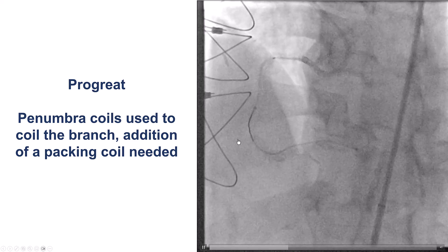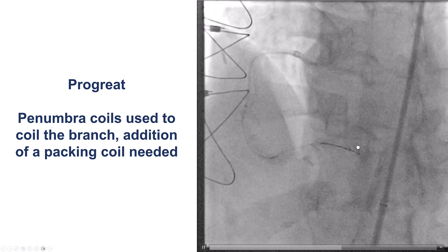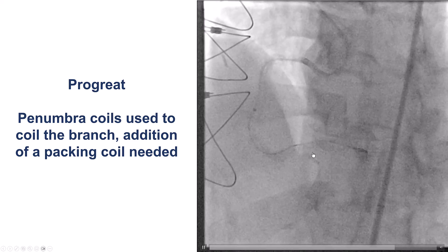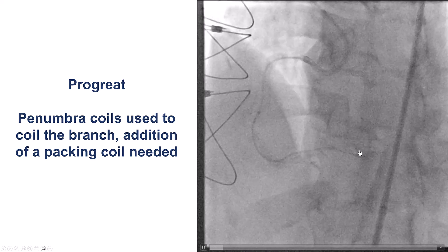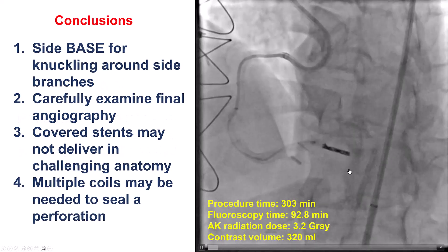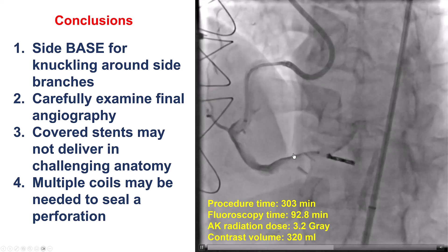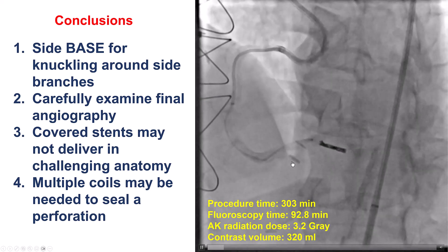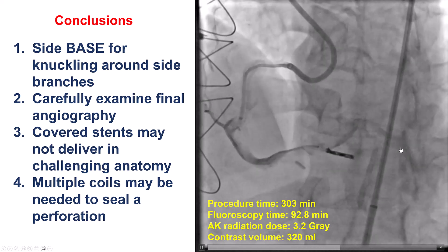We advanced a Progreat — a 2.8 French microcatheter — inside that little branch. We then used a coil, a Penumbra Ruby coil, into the posterolateral branch and overlapped it with a packing coil. That stopped flow into this branch while we still had flow going into the right posterolateral.